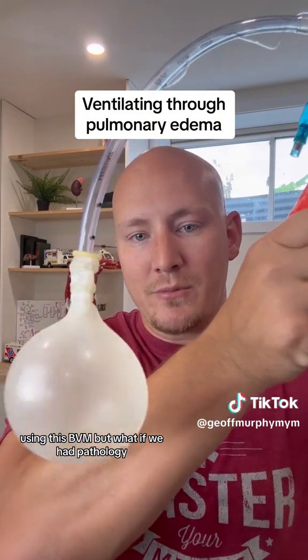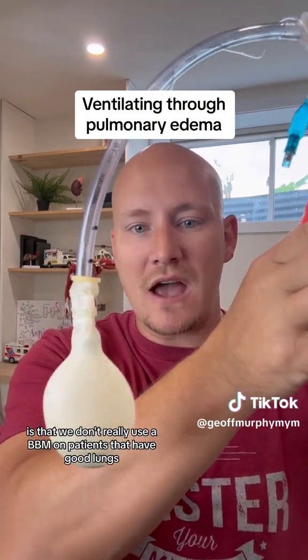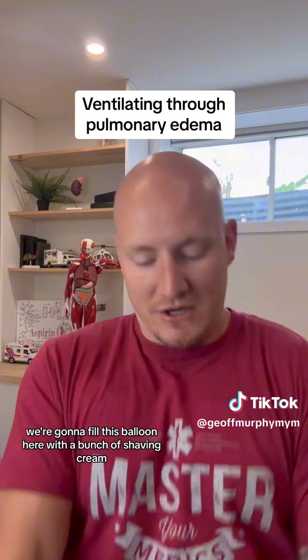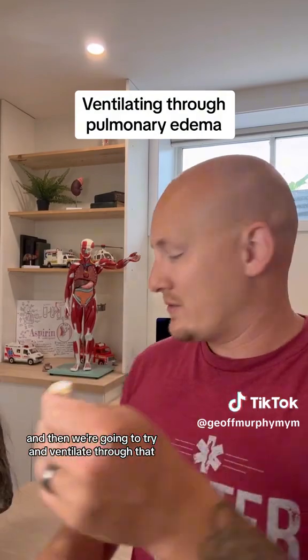But what if we had pathology? We often don't really use a BVM on patients that have good lungs. So what we're going to do is fill this balloon with a bunch of shaving cream and then try to ventilate through that.